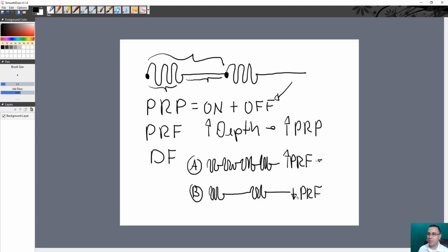So that means if you have more pulse repetition frequency, then you have less pulse repetition period. And then the other way around, B is working like this. Boom, boom, boom. It's just going deeper. A, for example, is going to maybe your common extensor or your common flexor in the elbow, a pretty short distance, but maybe B is going to the hip, and that's why the off time is longer, because the sound is going farther away.